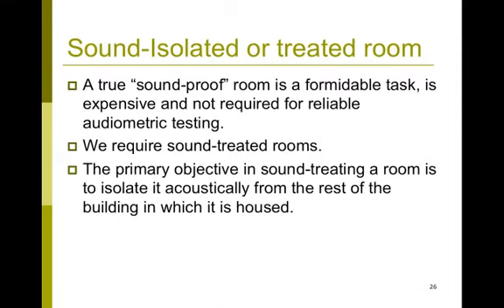The test environment, as I said, plays an important role. True soundproofing of a room is a very expensive endeavor and probably is not required to do reliable audiometric testing. What we typically see are sound-treated rooms. Again, the objective of sound treating a room is to isolate that room, as much as possible, from the rest of the building, so that we are not having any body-transmitted sounds from the rest of the building.